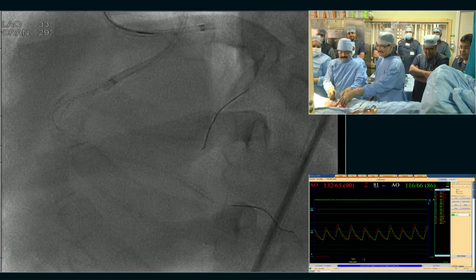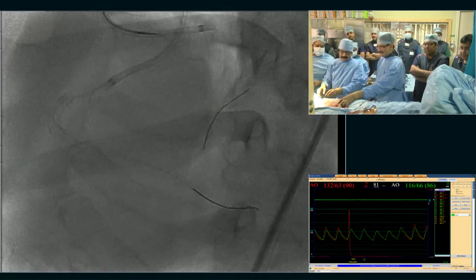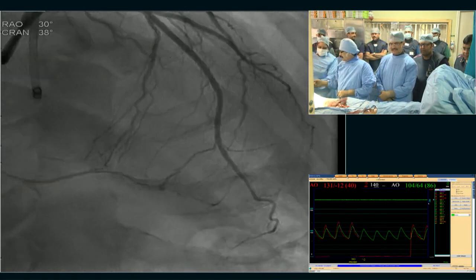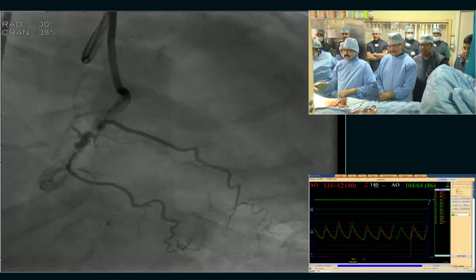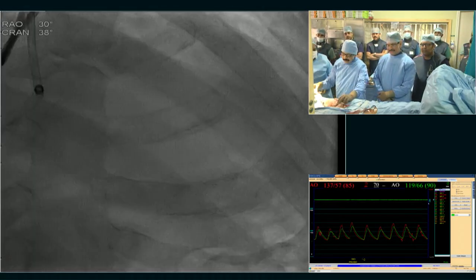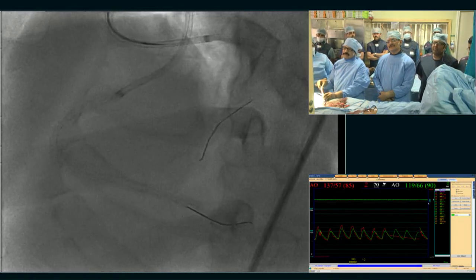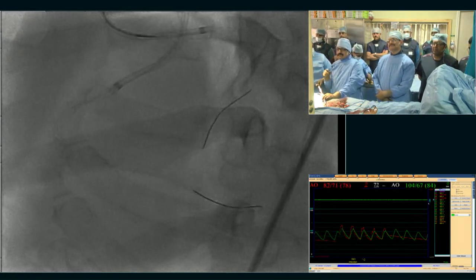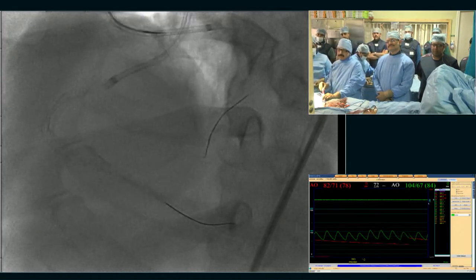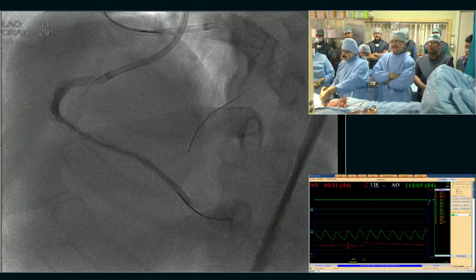So we saw the diagnostic angio, and it's an instant CTO. The long stent is going close to the crux, just beyond the bifurcation. We lost the PLV in the ISR, which is retrogradely filling from the left system. The PD, just beyond the bifurcation, is filling. So what is the strategy?